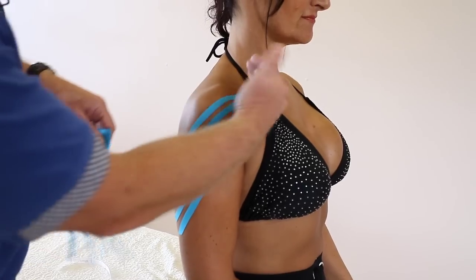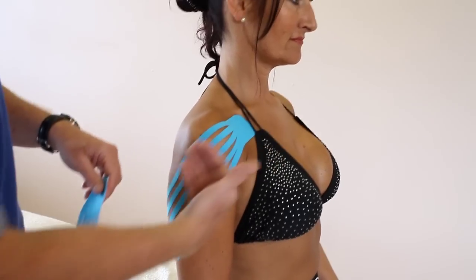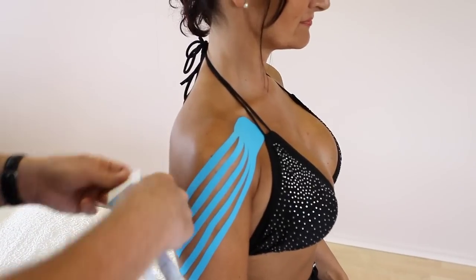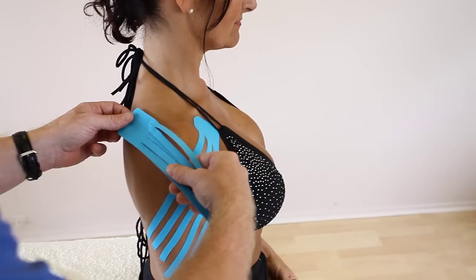So the second one — think about where this one has come from. We're going to do a similar sort of thing, it's more anterior coming from the posterior. And now we're going to do a posterior one. Again, break in each finger and we can feed that on that side like there.